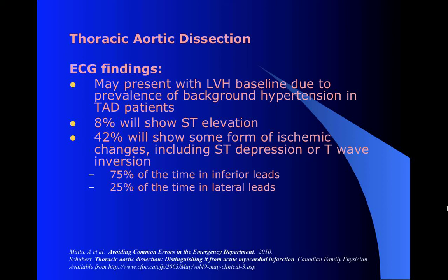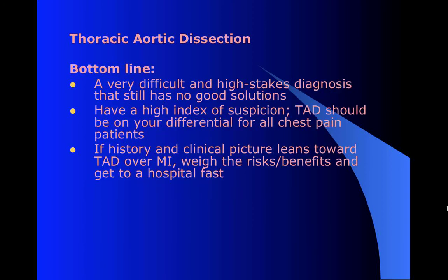Many more will have more like an ischemic change with depression and T-wave inversion. Often it's in the inferior leads, occasionally in the lateral leads, so it does have anatomical localization, but there's nothing that really will be distinctive. So these are tough. It is high stakes.